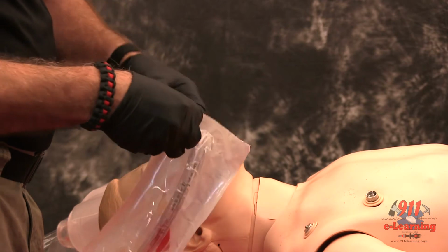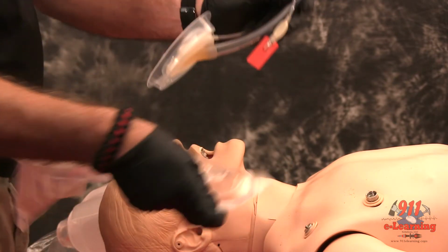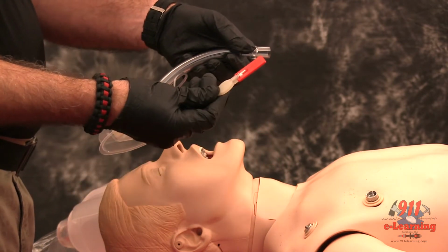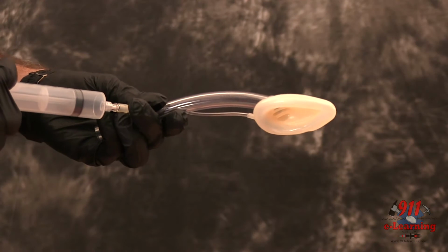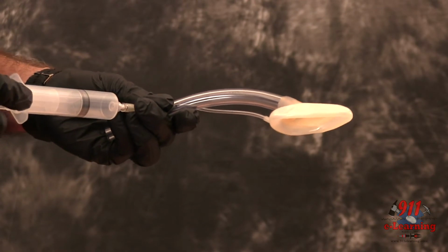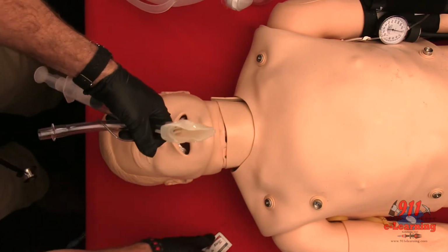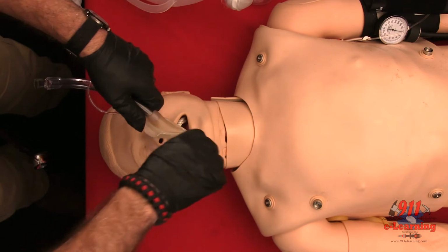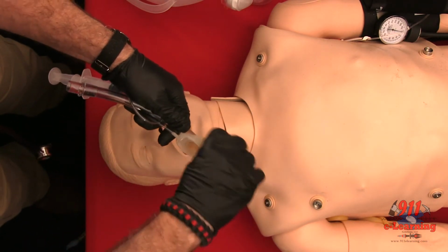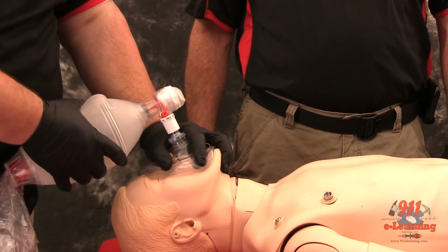Select the appropriate tube size for the patient. Check the tube for proper inflation and deflation. Completely deflate the tube prior to insertion. Lubricate with a water-soluble jelly. Pre-oxygenate the patient with 100% oxygen.